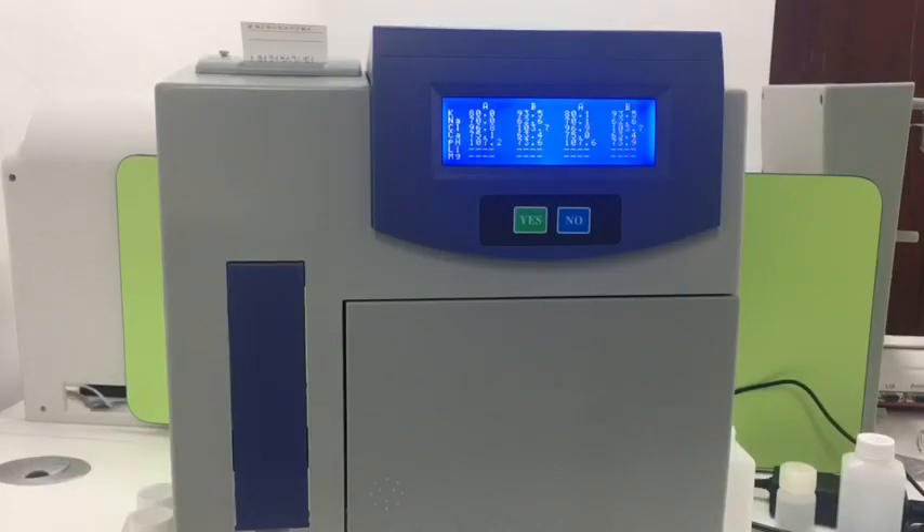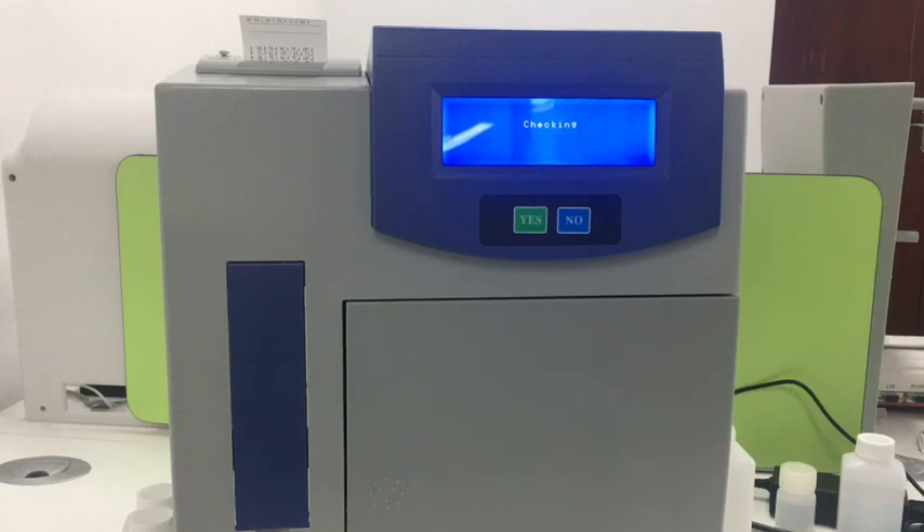After a while, it will show you the calibration data: A1, B1, A2, B2. It will take one more minute to finish, going through self-checking and self-washing. So it will take a while to complete the calibration procedure.